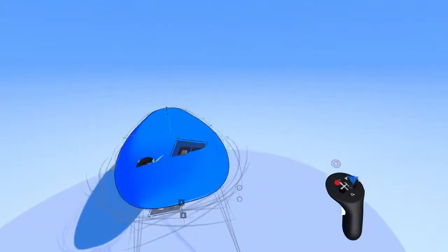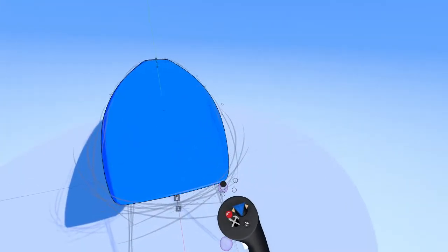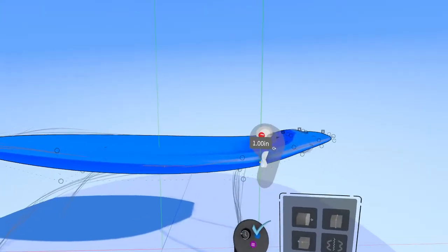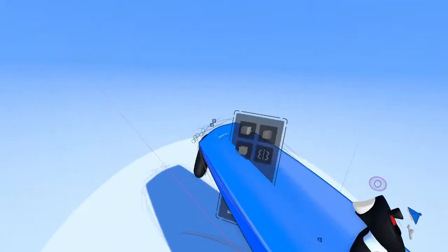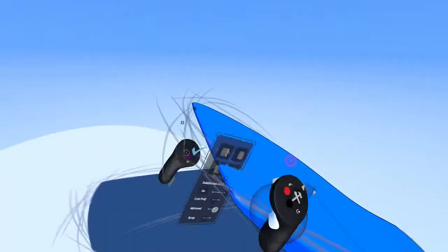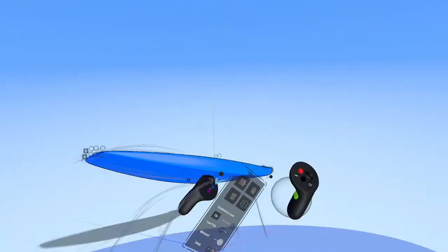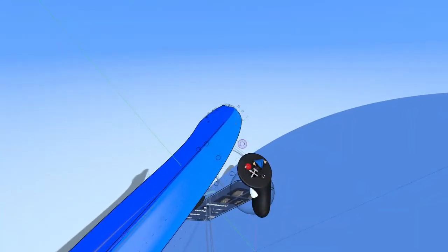Yeah, if we wanted to tighten up this radius a bit, we could click and drop in a whole new edge loop going this way, and then add some shape to the bed like this. Could drop in another loop like that. So the tools in Sub-D are pretty simple. Basically, you're just adding edge loops, moving faces around, and that's about it. So once you know those features, pretty much good to go.